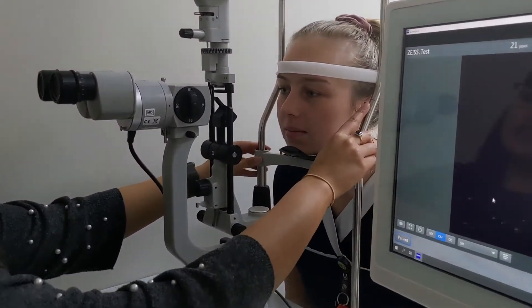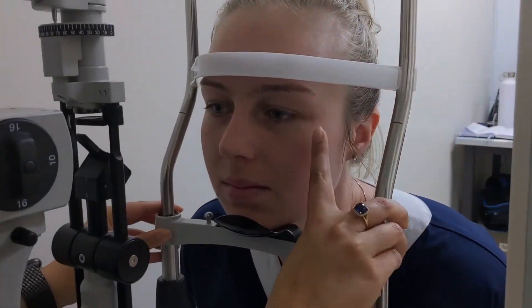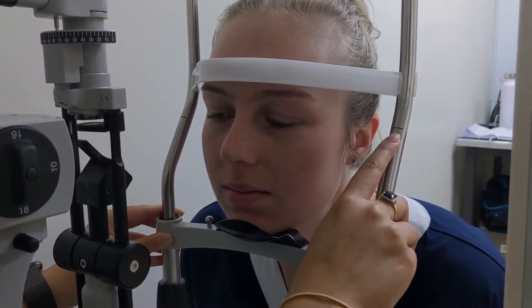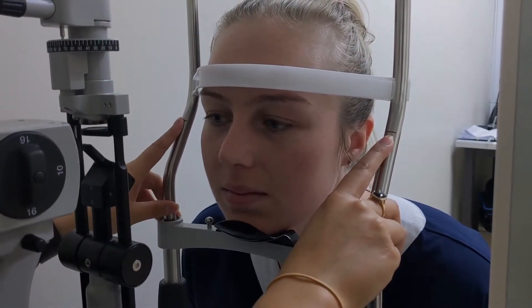Get your patient to place their chin on the rest and make sure their forehead is firmly placed on the top. You want their eye level to be level with this canthus mark here in red, and it's marked on both eyes.